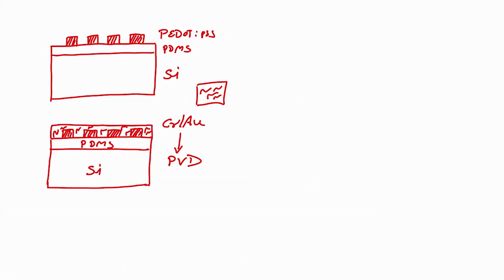Why do we need chrome? Chrome is required for better adhesion of gold, right. So, gold will stick well. Now, after this, what is the next step? The next step would be, we all know, right, what is the next step?